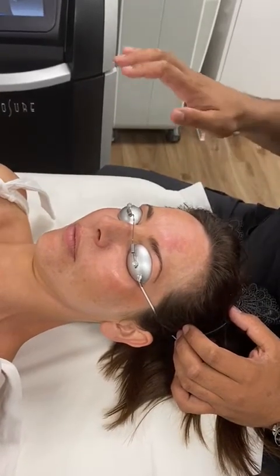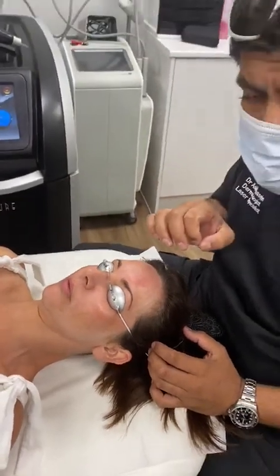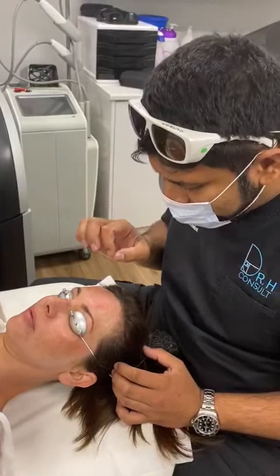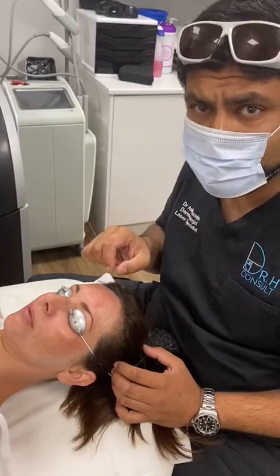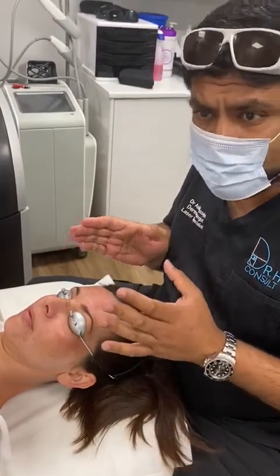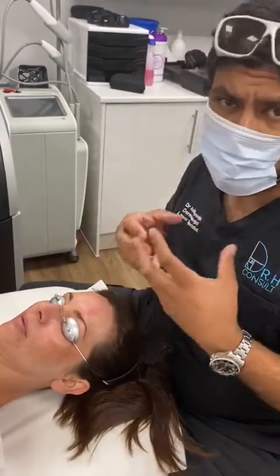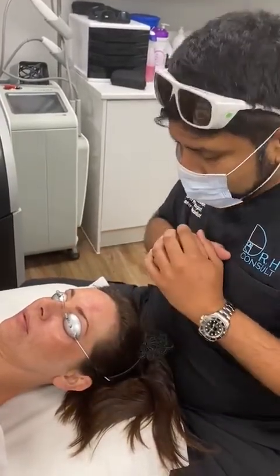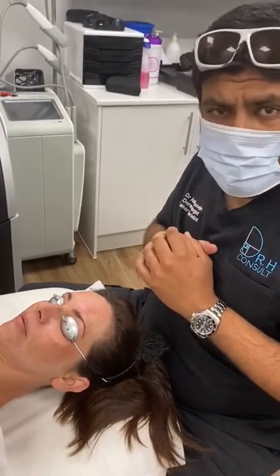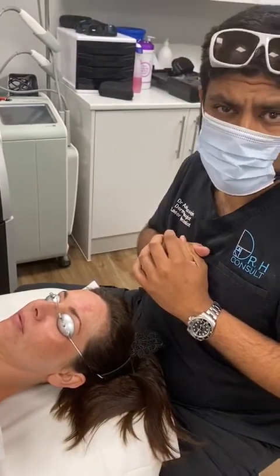The key about a laser like the PicoSure 755 nanometer is that you're going to get the best capture of melanin. The other lasers in the picosecond range often have wavelengths that interfere with blood vessels as well, such as the 500 to 650 nanometer range, which also captures blood vessels and causes diffuse trauma throughout the skin. The advantage of the 755 is we don't really touch the blood vessels, but we nicely hit the melanin — we hit the target we want without too much concomitant damage to the skin.